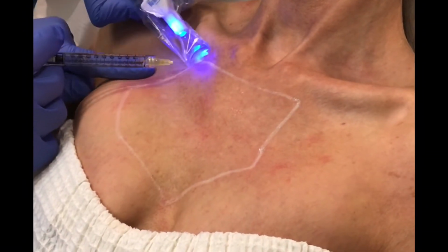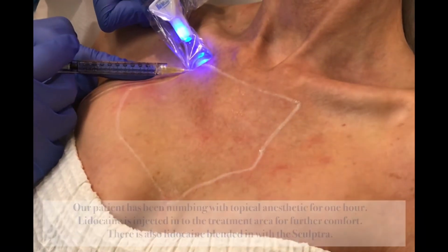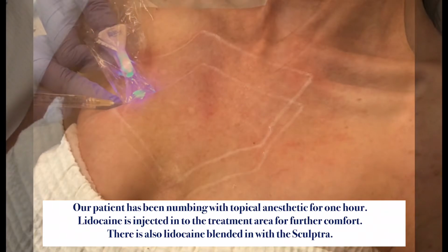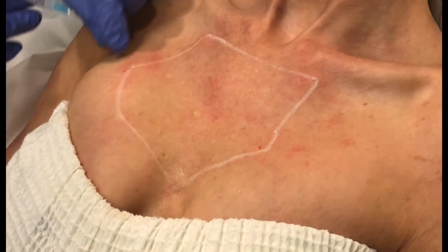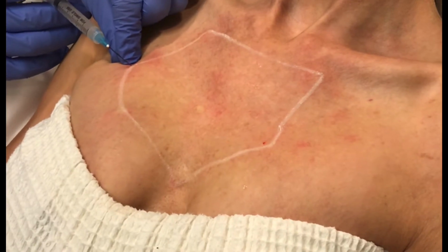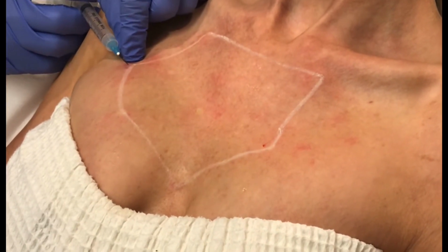We'll just place some numbing dots at certain corners. Yeah, that's good. Okay, so we'll start our treatment. We'll just place the Sculptra and we'll fan it.